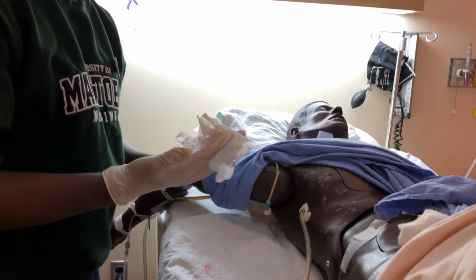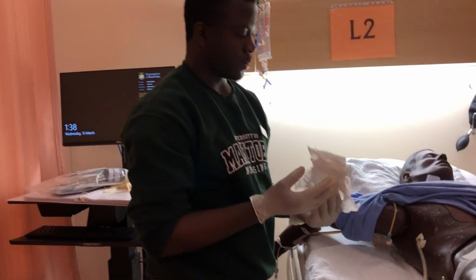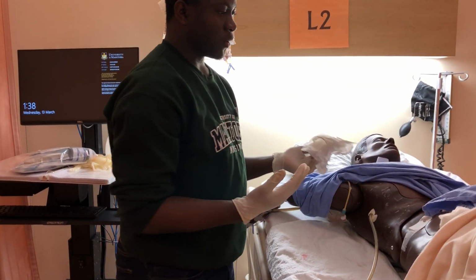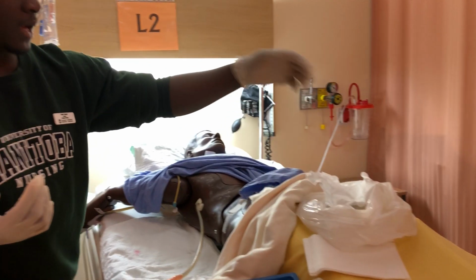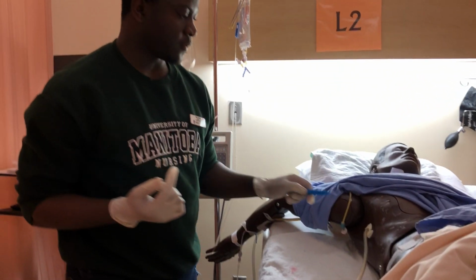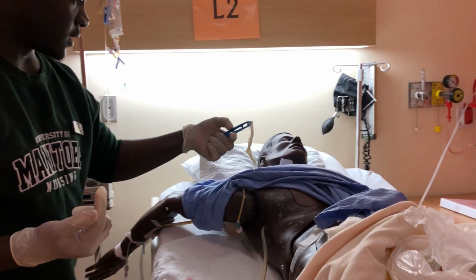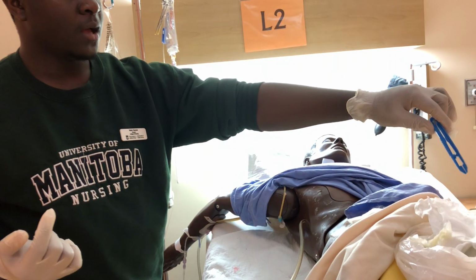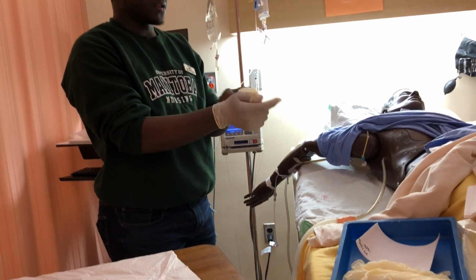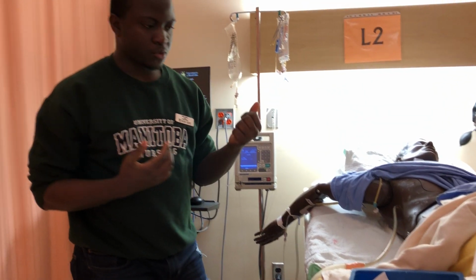So I will just examine this dressing and I see that it looks intact. There are no signs of bleeding or anything, and the wound site also looks intact. I will just discard that. So now there's no redness, no sign of infection. I can use this forceps to take out the Jelonet, and I also notice how it looks, and I'll just discard that, and I'll discard that as well. And at this point, I can discard these gloves and wash my hands to get new gloves as I'm going to be starting my procedure.